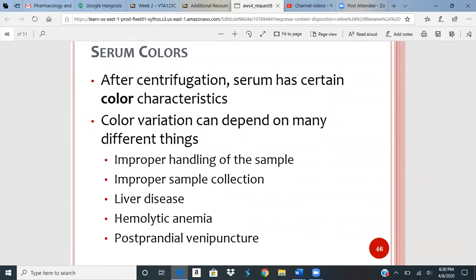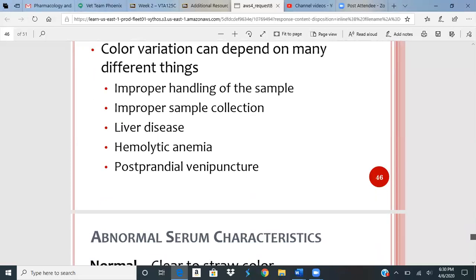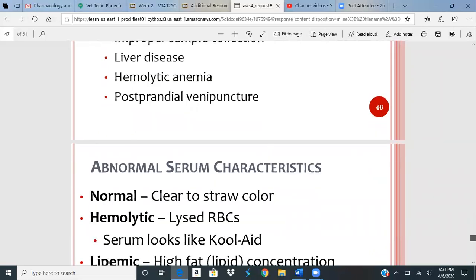Again, the color of the serum, like I was telling you, can change if we've lysed those blood cells. It could be a pink color. We normally want to see what looks like straw. Now, the color can change if it wasn't handled properly. Let's say we were fishing around for that vein too many times with our needle, coming out and redirecting. You did it so many times, you actually started lysing the blood cells. That's another way. If they have liver disease, it's going to turn that serum a yellow color because of the bilirubin. And then hemolytic anemia, if they have something going on, that's definitely going to change the way it looks. And then our venipuncture, the way that we do it, can again affect the way it looks.